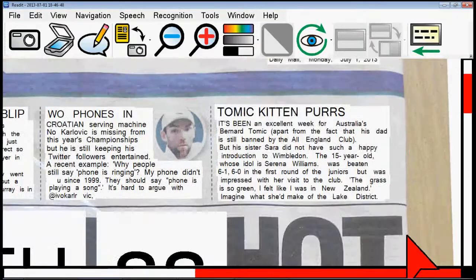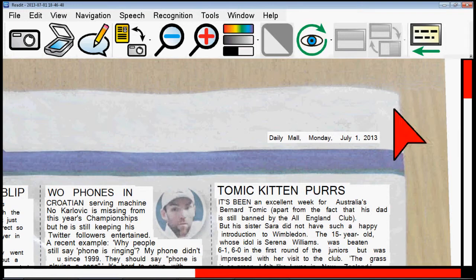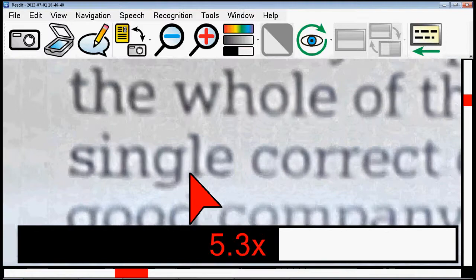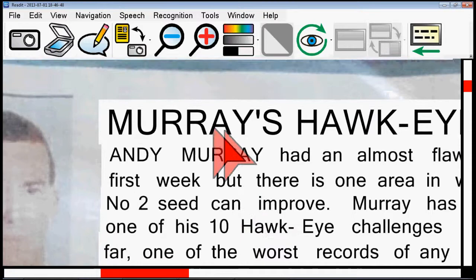It's now OCR'd the entire A3 page. We've got a topical Wimbledon newspaper section on there — some of the Brits are still doing quite well in Wimbledon, although one of the ladies has just gone out. We've got the same views on here, so we can zoom in on the original image view to get an idea of what the image quality is like. We've got our overlay view, which replaces the recognised text with the actual font, which then makes it perfectly clear.